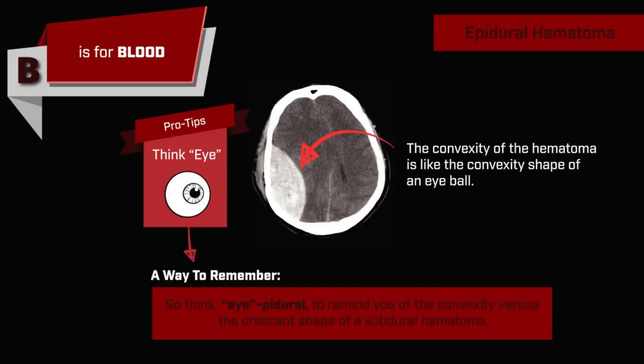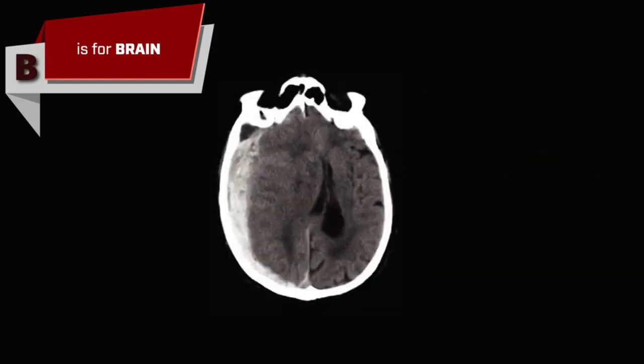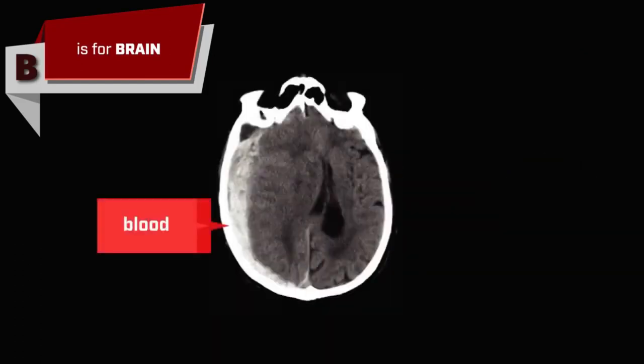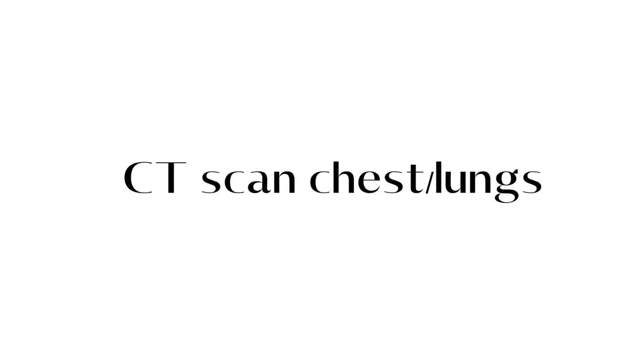Head CT. A doctor might order a head CT for a patient who is experiencing unexplained headaches or dizziness. The procedure can also help diagnose brain tumors or strokes. A head CT captures images of the brain and other areas of the head, such as the sinuses. Patients with ongoing sinus issues might benefit from a head CT to determine if there is ongoing inflammation in the area.